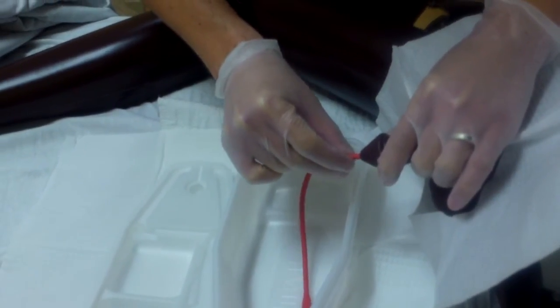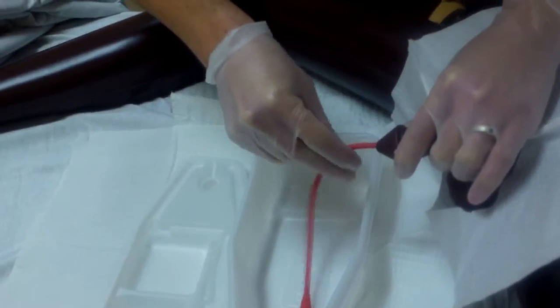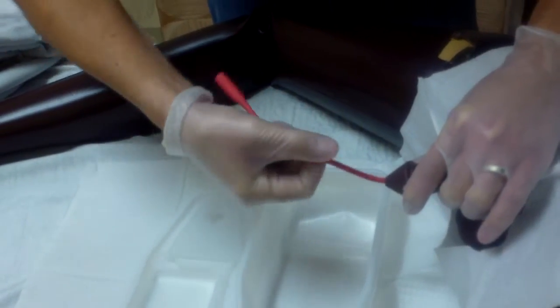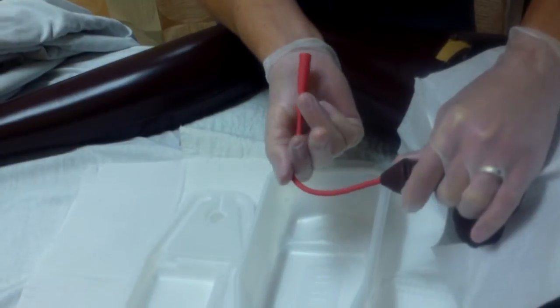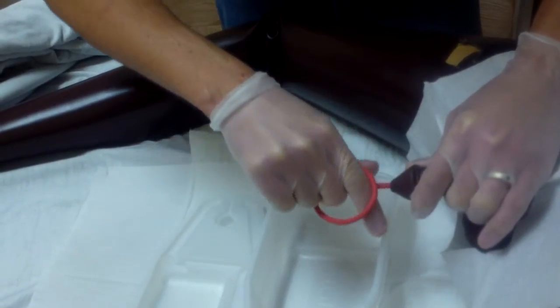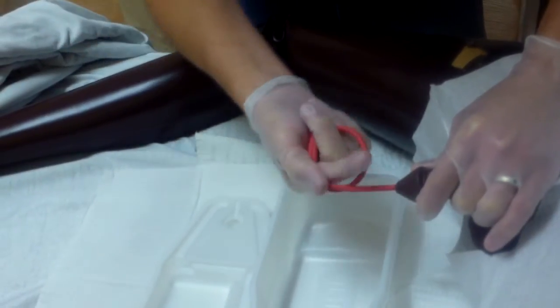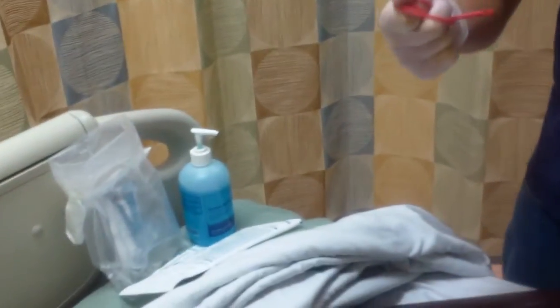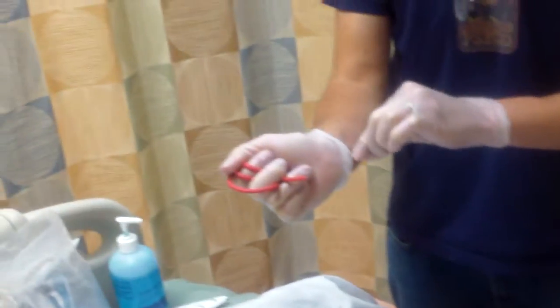And then after that, I would grab this, because now I got a basin full of urine there. I would then very carefully, I'm going to tell him that I'm going to be removing it and that he just needs to kind of bear down with me one more time. We're almost finished with this. I would curl this up and I would remove it very carefully. And then I would release, and then I would remove my gloves.